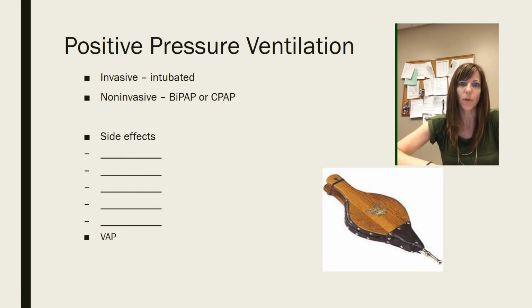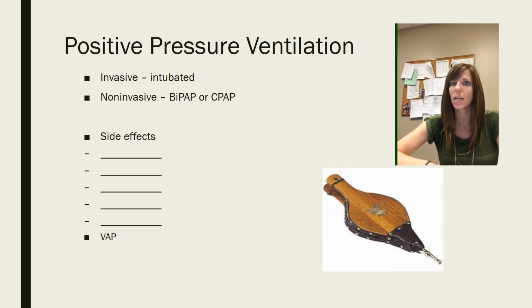And then we also talked about the home ventilators or the transport ventilators. I'm going to add to that, sorry. But we have invasive and non-invasive. Non-invasive ventilation is with a mask. If you know anybody who maybe has sleep apnea, and they have a CPAP machine at home, that's non-invasive. We're pushing air into the lungs non-invasively, meaning we're not going inside the body.